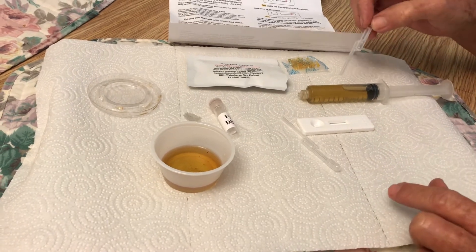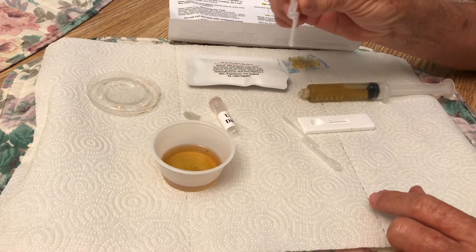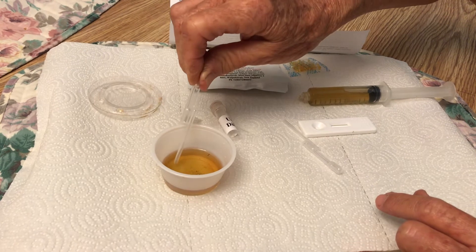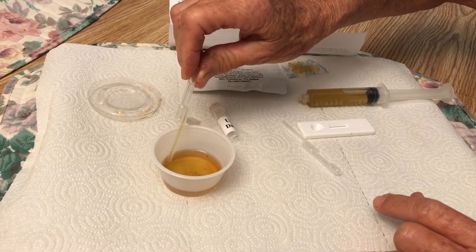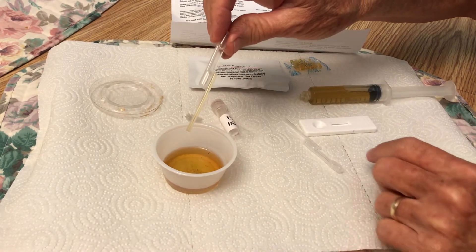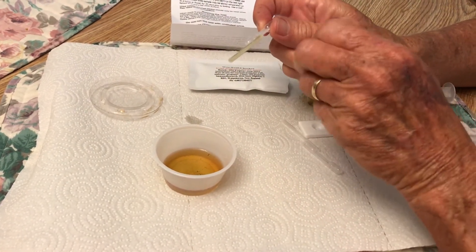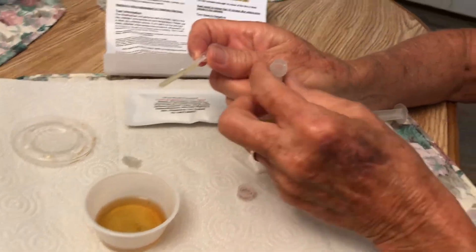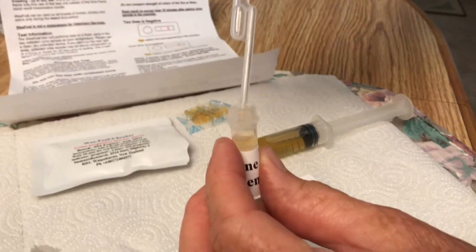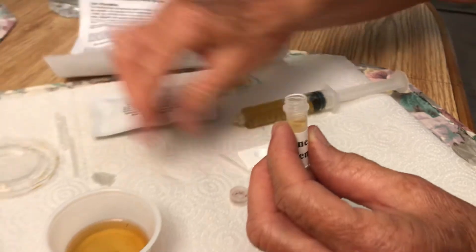I've got a urine sample — this is some of it. The first thing you do is squeeze the bulb on this pipette and get a little bit of urine up in it, just in the bottom part of it. Then you take this urine and put it in the dilutant right here. Squeeze it on in there — easy peasy. Set that aside.